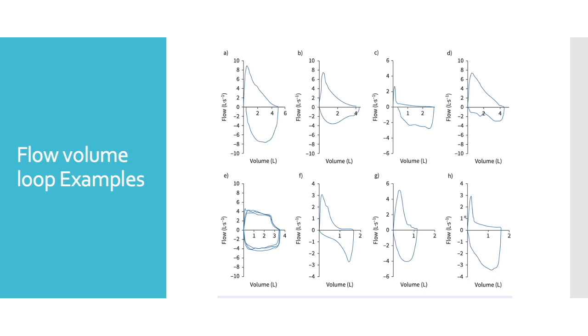Coming to this one, you see the flattening of both expiratory and inspiratory. We all recognize it now. It's a fixed obstruction of the large or central airway. This is a newer pattern in this guideline where you can see there is an irregularity. So the inspiratory curve, if you see, it shows a concavity here, and this is the expiratory curve. So this typically would happen if you will have a unilateral bronchial obstruction. So while this patient is inhaling, one is normal and one is blocked. So you may get a partial kind of a pattern, a unique pattern.